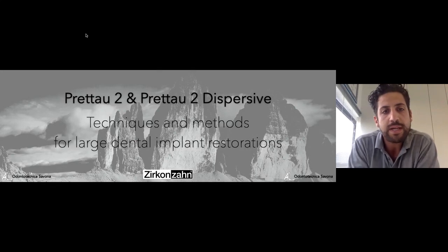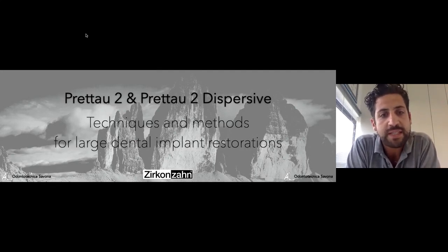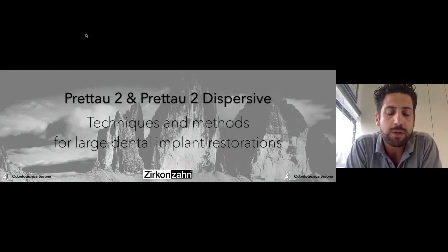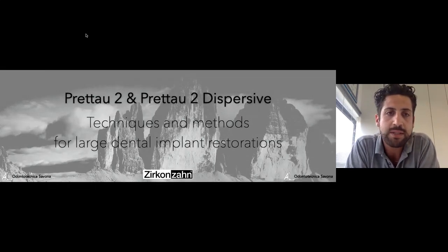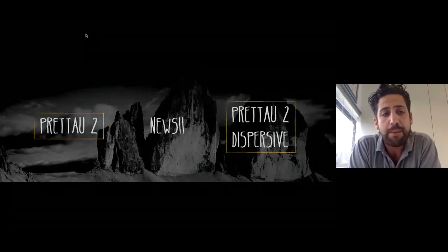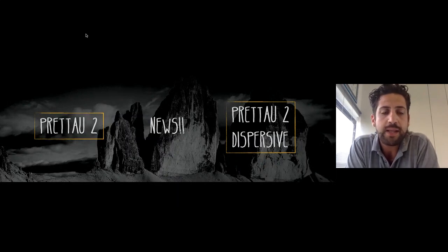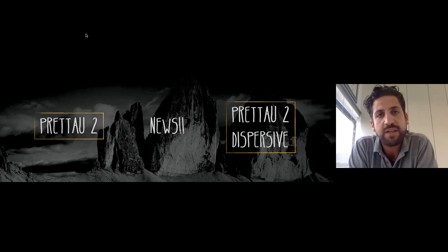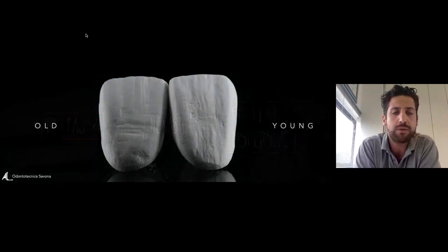So today I would like to speak about Prettau 2 and Prettau 2 Dispersive, techniques and methods for large dental implant restoration. Today we'll focus on these two new materials by Zirkonzahn. First of all, we will explain about Prettau 2. This is a new Prettau white, which means it needs to be infiltrated. And the Prettau 2 Dispersive is a pre-colored zirconia. But let's speak about Prettau 2.